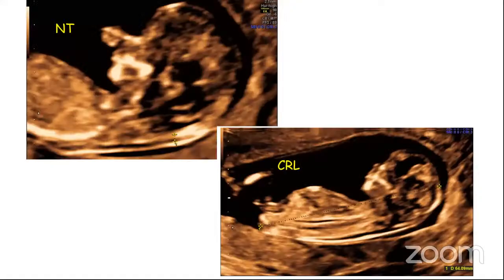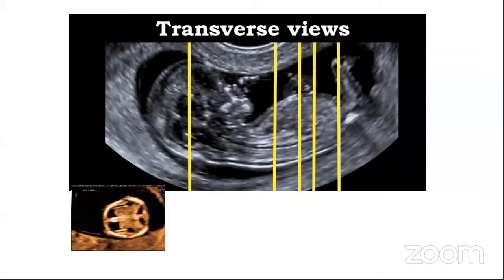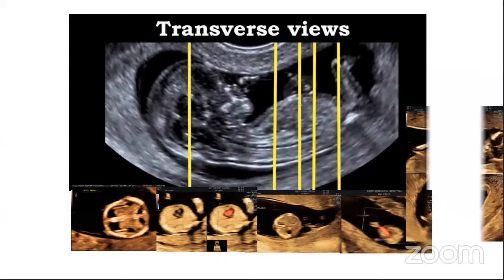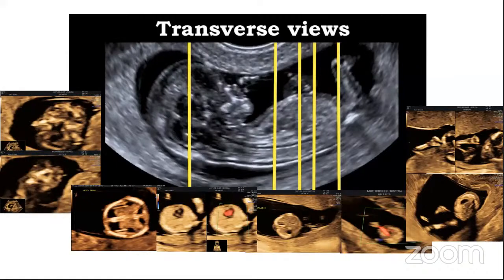These two classic images have been explained in much detail. And how do we assess the fetal anatomy? We see beyond these classic images in an axial scroll from head to rump. We see the axial sections of the fetal head, brain, heart, thorax, the stomach, and the abdominal wall insertion of the umbilical cord. A lateral sweep shows us the upper and lower limbs in all three segments, and a slight oblique view shows us the orbits with lenses and the retronasal triangle.